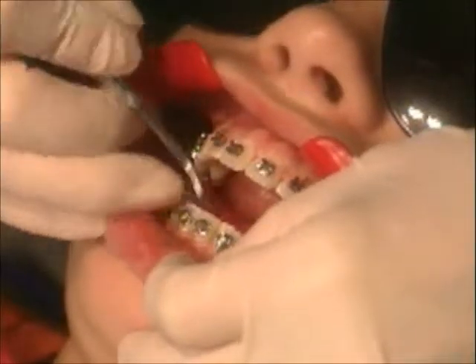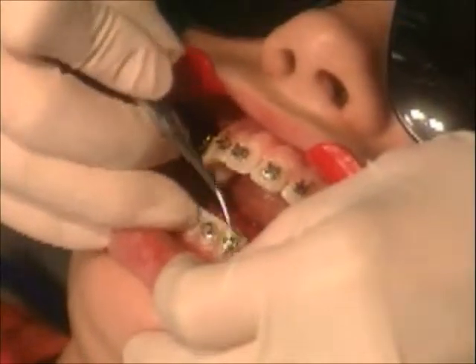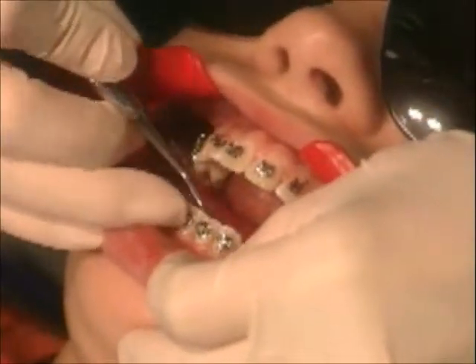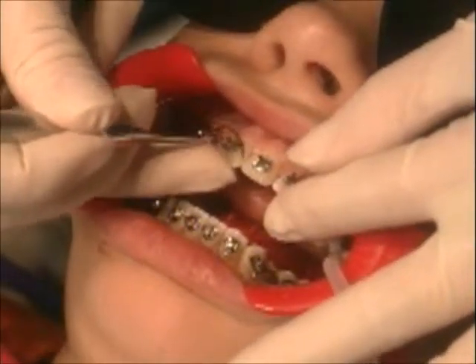Remove any excess flash from the lower arch. Flash will be minimal if resin A and resin B were applied in a thin layer. Repeat for the upper arch.